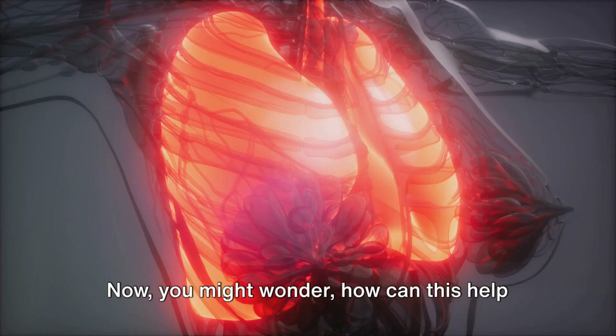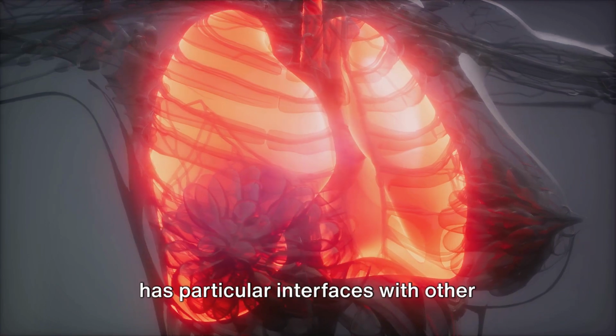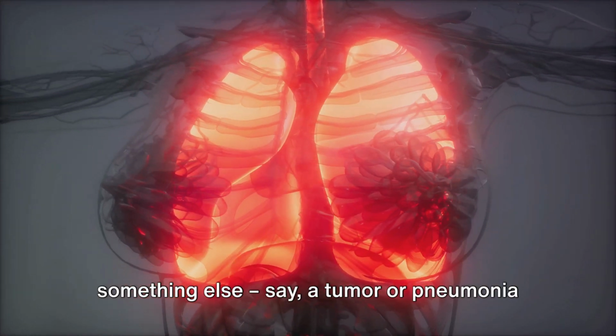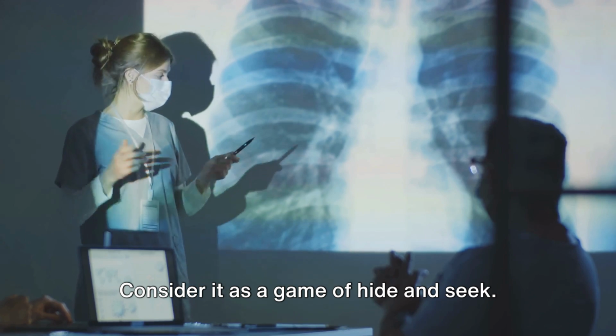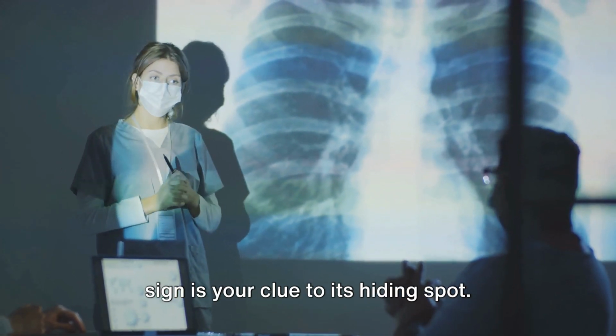Now you might wonder, how can this help us locate disease? Well, each lung segment has particular interfaces with other structures in the chest. When normal lung tissue is replaced by something else, say, a tumor or pneumonia, it causes a loss of the normal silhouette. Consider it as a game of hide and seek. The disease is hiding, and the silhouette sign is your clue to its hiding spot.